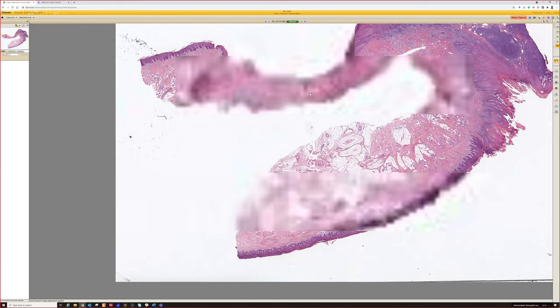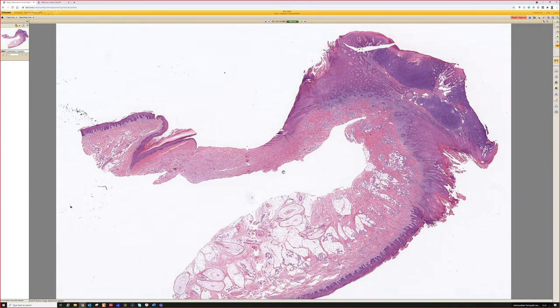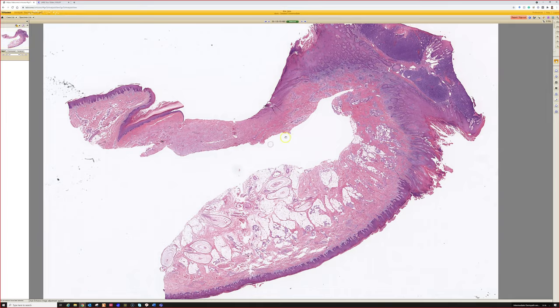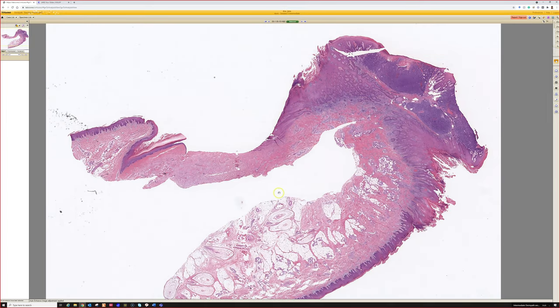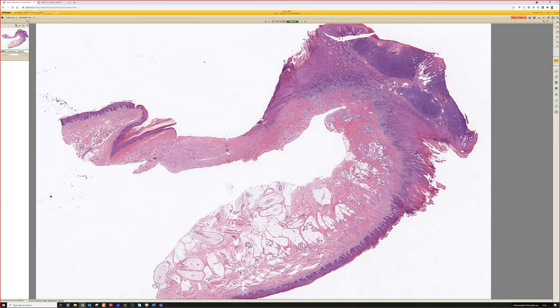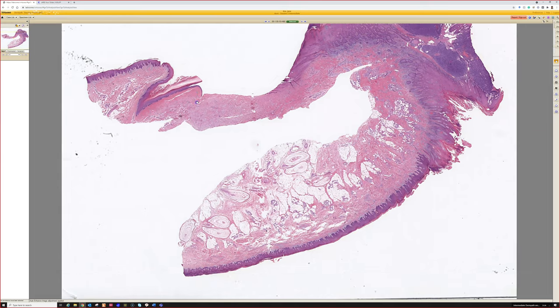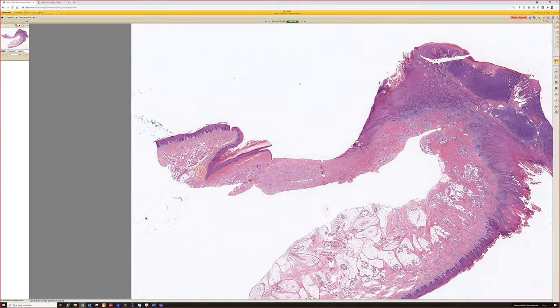Case 10. Oh, I guess I should show you the tumor. Well, where are we here? What kind of specimen is this? Yeah, this is acral skin, and look at the shape of it. How did they get this? Is this a polyp? What's going on here? What's this?